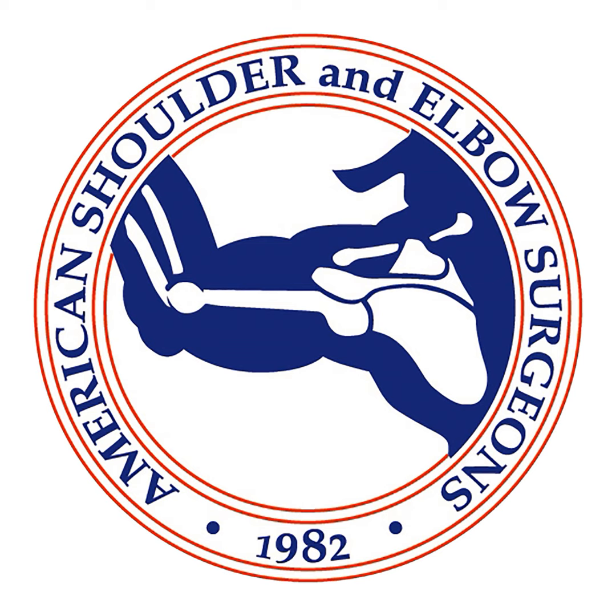So to answer the question about the canal, I think we're going to see that it's really going to depend upon a surgeon's training, because like Dr. Sperling, I haven't done a stemmed anatomic in a long time, other than maybe in the last couple of years, one case or maybe two, where the bone was just so soft in the metaphysis that we had to use a short stem instead of a stemless. But almost exclusively for my primary anatomic total shoulders, they're stemless.